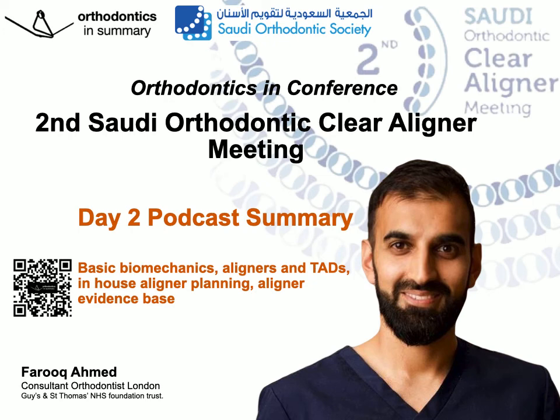And it showed that there was 60% prediction with no attachments. When there was an attachment, it was increased to 70%. But actually, as they increased the attachments on the adjacent teeth, whether it was buccal and lingual, the accuracy reduced. And how counterintuitive is that? But it actually went down to 27%. And what Key said in a very frank sense and very informed was that we don't truly know how attachments work with the interaction with the aligner.